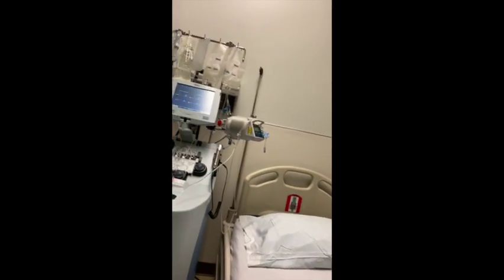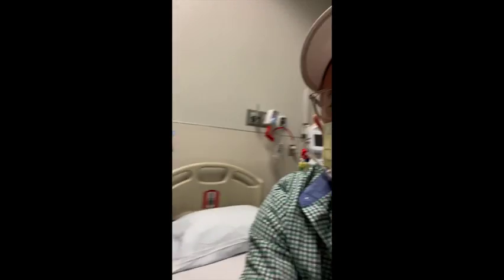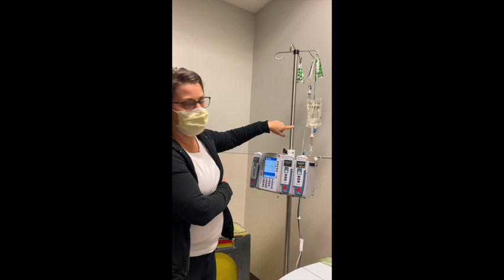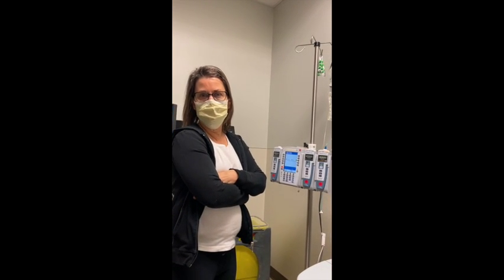Here's the machine. Pretty soon they're going to start sucking that stuff out of me. What is it? This is calcium gluconate, and this is just normal saline — they'll just wipe that in. But let your nurse tell you.